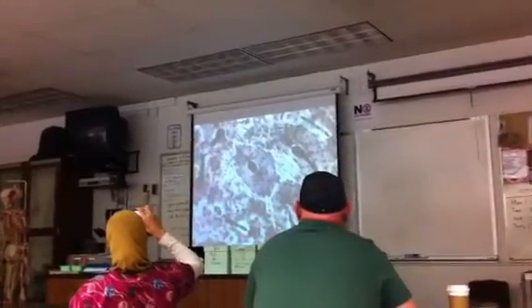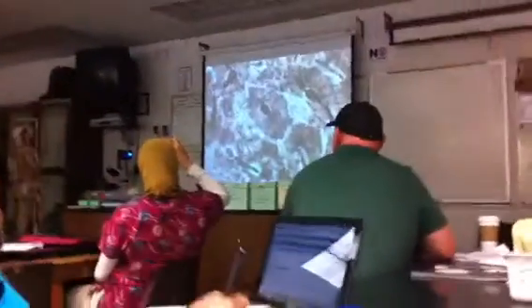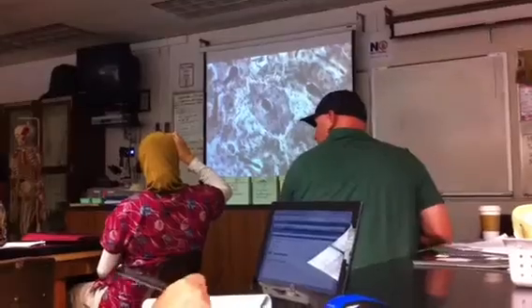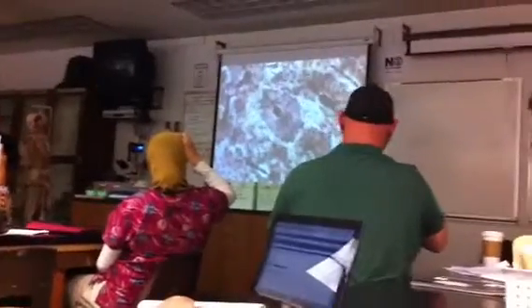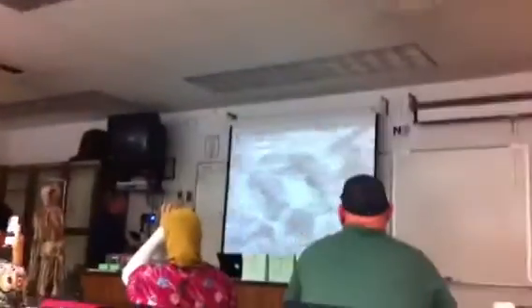Okay. Now, I'm not sure on this slide if you can see the other lamellae. I know you can see it on that model sitting on the middle table, but that's the lamellae along the circumference, the border of the bone, and that's the circumferential lamellae.